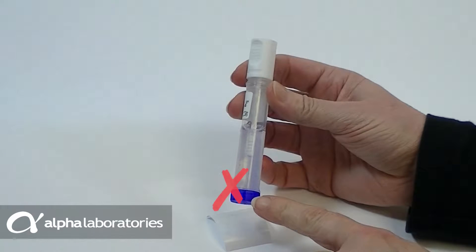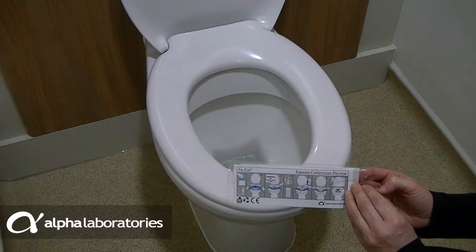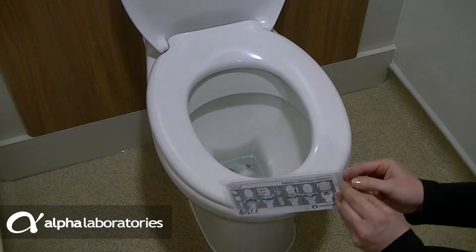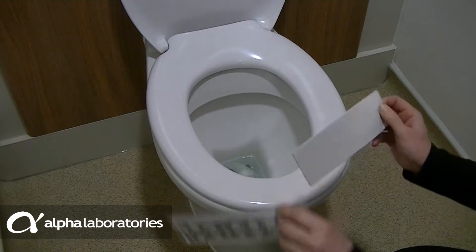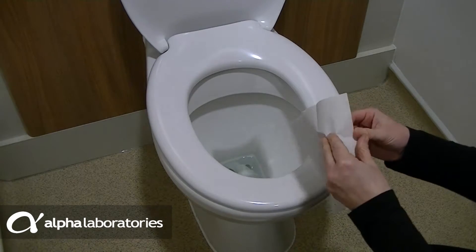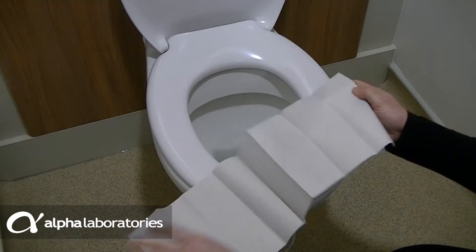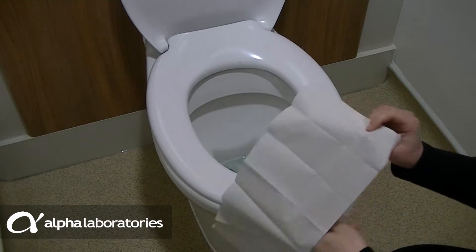Do not remove the blue cap from the Calix Cap. The easiest way to collect your sample is with the Fecol disposable stool collection paper. This is easily and securely placed on the toilet and can be flushed away entirely after use. Open out the Fecol and slip the simple paper loop over the toilet seat, positioning it slightly towards the back.